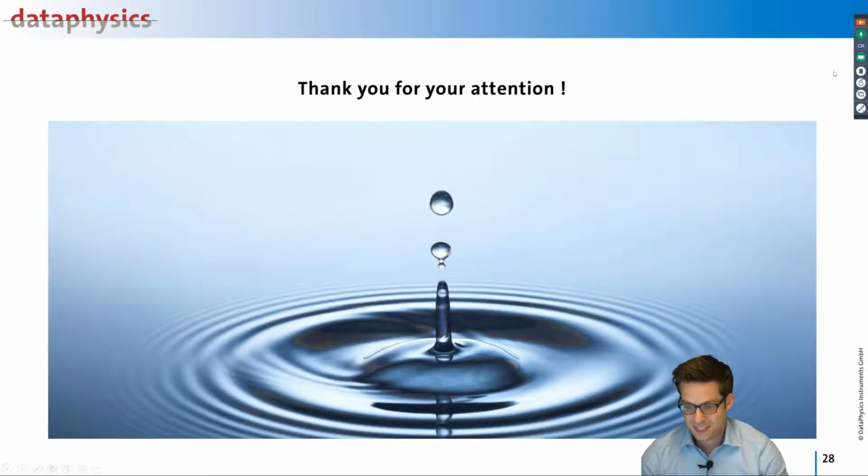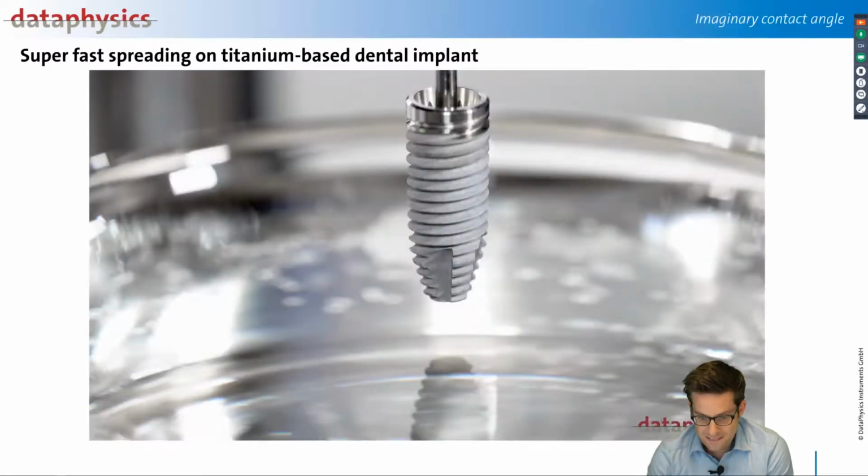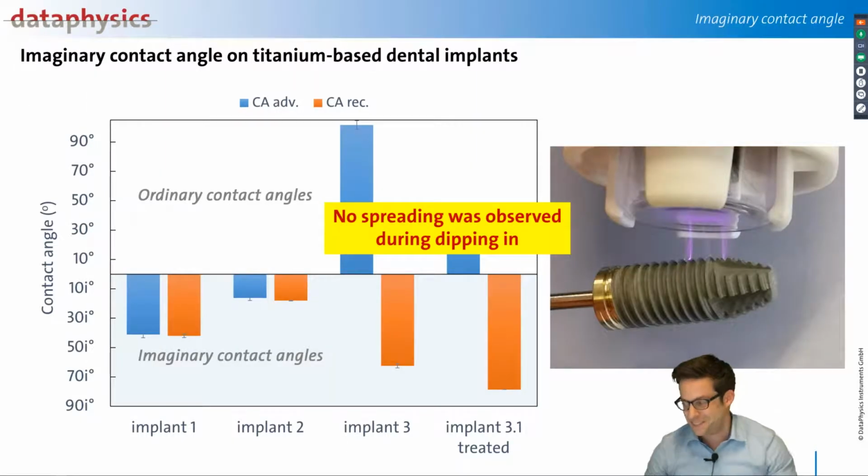There are several questions. The first one is whether the hyperhydrophilic implants lose the hyperhydrophilicity if you store them for some time. Yep, this is in fact the case. I do not know, normally these implants have a hydrophilic coating, and I do not know how long this coating will keep inside the box, but we know that if the implant is plasma treated, for example, the plasma treatment will not keep forever on the surface. So if you let it lay around for a couple of days, then I think it goes back to the initial value. So the plasma treatment is time dependent, I would say.